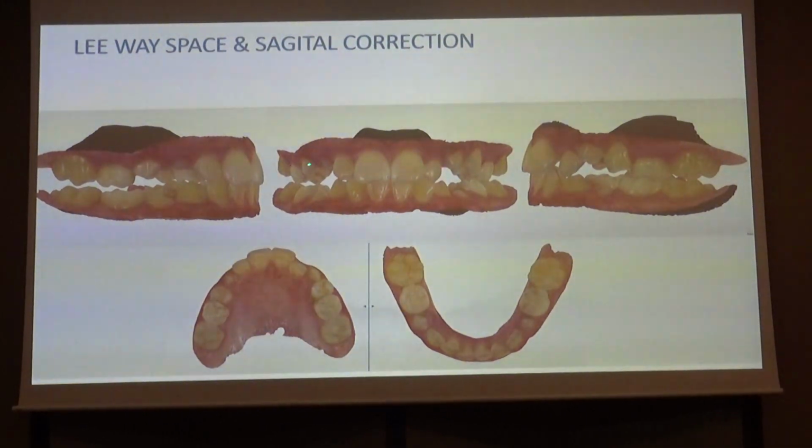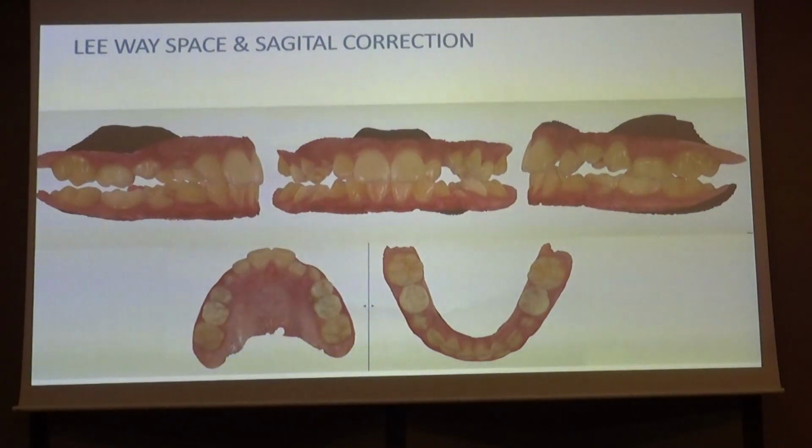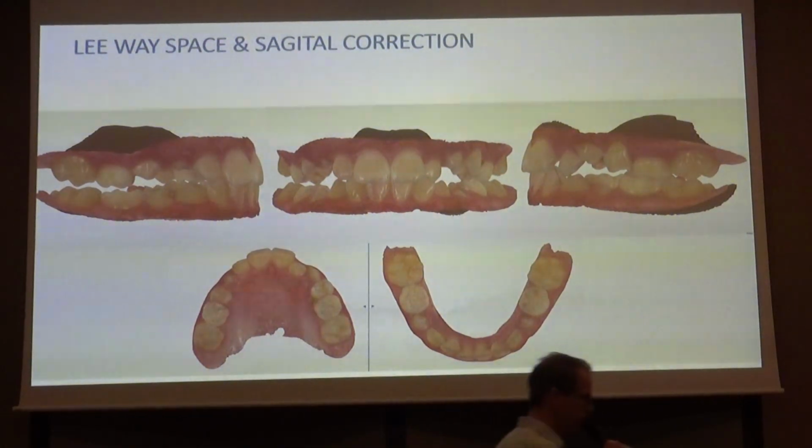And one of our main concerns always was to move the root of the laterals, or usually the laterals, in the direction towards the crown of the canine. And actually this was very easy to do. If I bond the bracket of the lateral in the 2x4 in a wrong position, I will tend to promote this root movement in direction of the canine, and so I will have resorption of the root of the lateral.